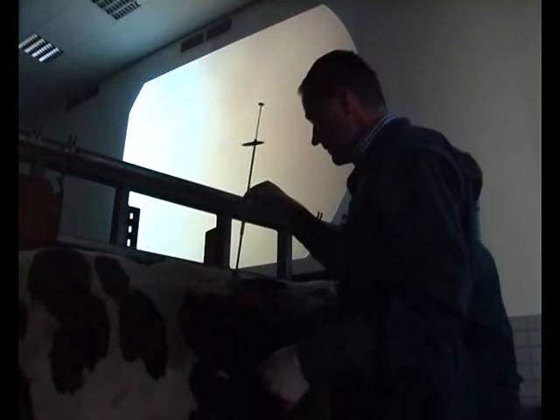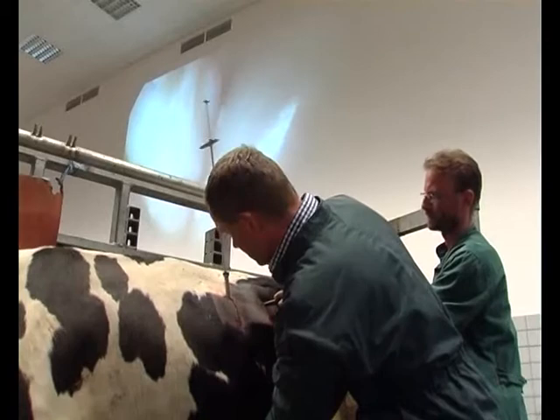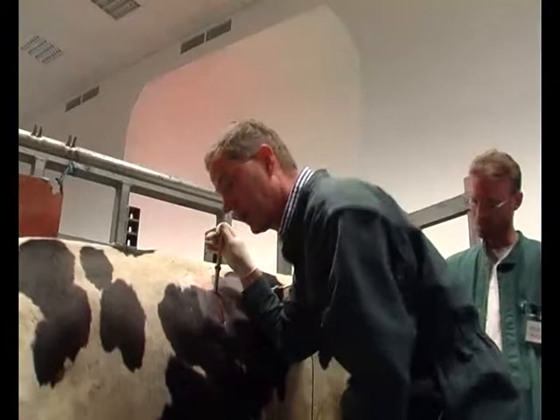I just brought it a little bit higher, bring it to the abdominal wall, and don't force, and just let it go down by itself, and then you, I can see it here, and then you go down. And you shoot, you know you're all right. Now it kicks on the left. And if you are in a good position, then it starts to kick on the right.